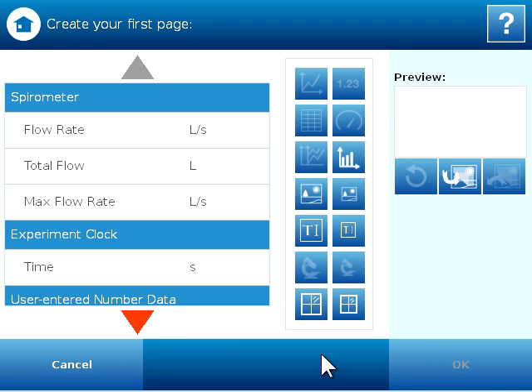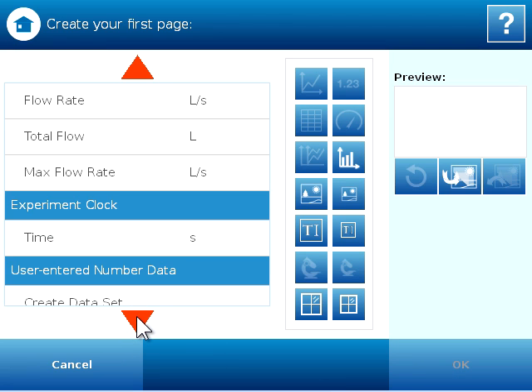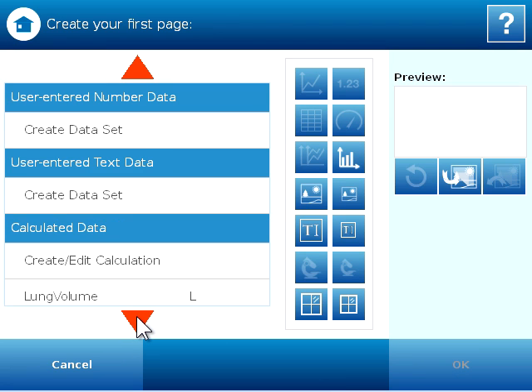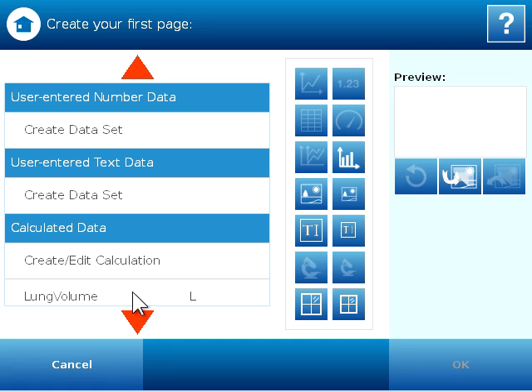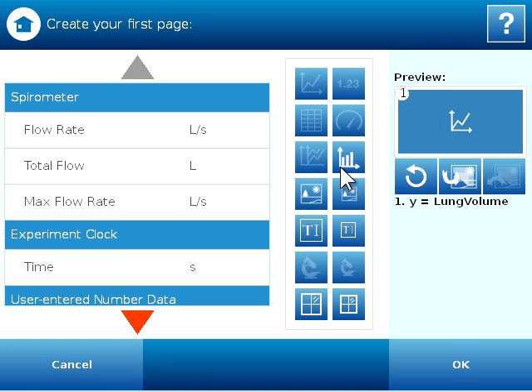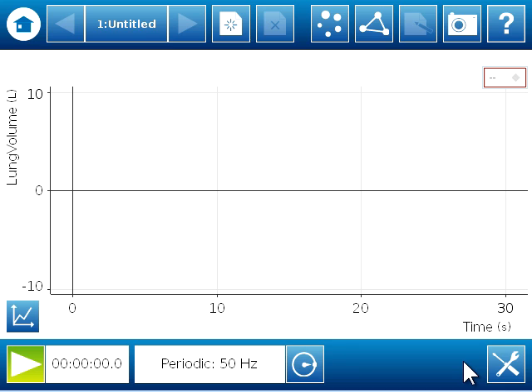So I can click done, and if I scroll down to calculated data, you'll see I now have my calculated value of lung volume in liters. So I'm going to select lung volume. You'll see it highlights in orange when I've selected it, and I'm going to choose a basic graph display. So this will give me lung volume over time, and I can click OK and see that display.